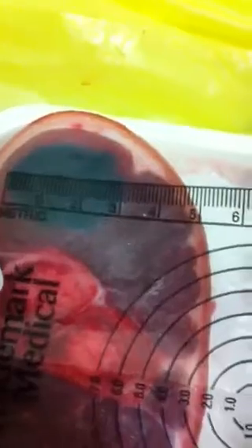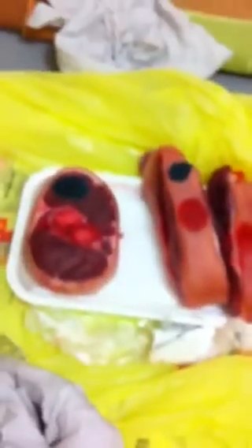Now we will directly measure it on the wound itself, and that is going to be 2.1 centimeters in length and 2.9 centimeters in breadth, which is 6.09 centimeters squared. So the discrepancy we have is between 6 and 6.09 centimeters squared.